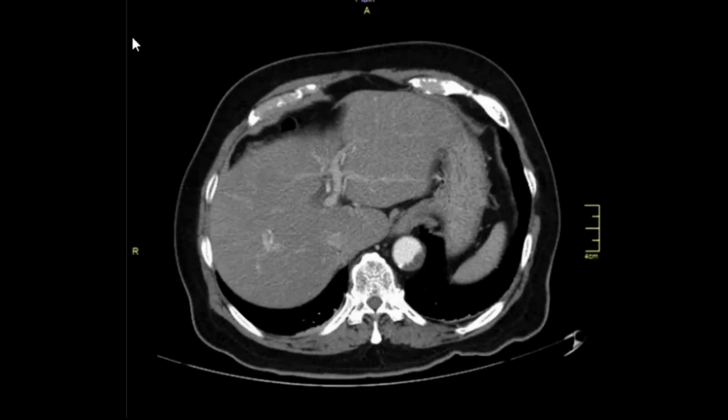Hello everybody. This is part 2 of our acute abdomen and pelvis series. We went over a couple cases in the prior video, and in this video we'll go over the answers for the cases. Some of these are acute conditions, others are signs that indicate impending acute condition.